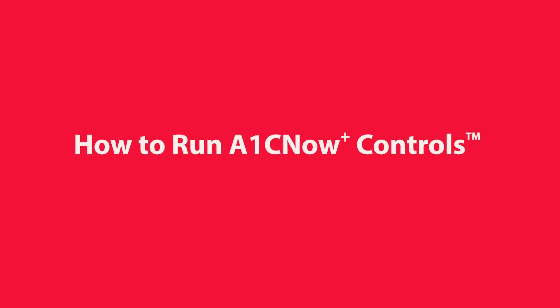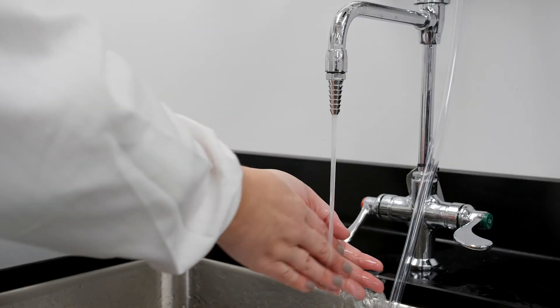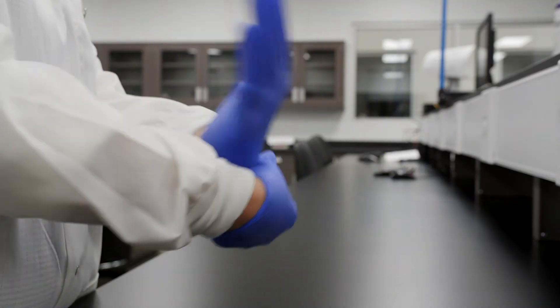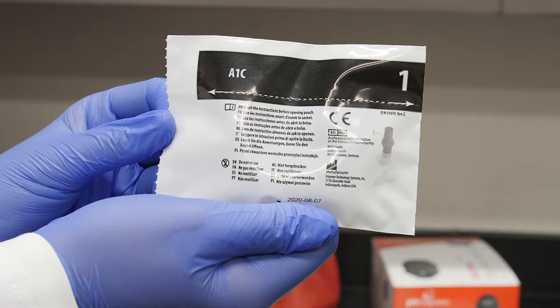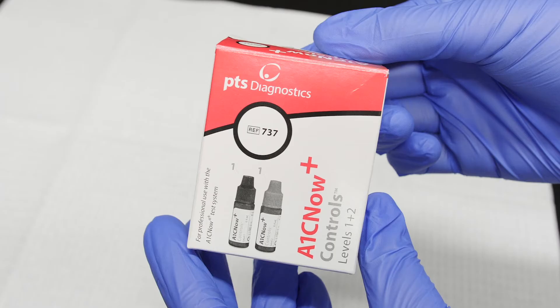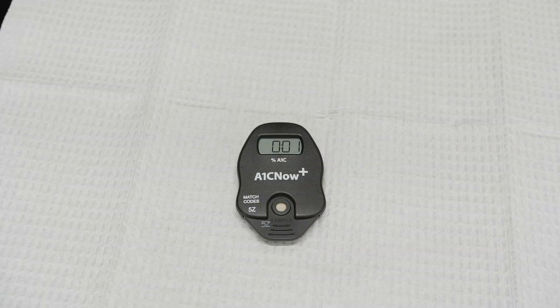How to run A1C Now Plus Controls. First wash, thoroughly rinse, and dry your hands, then put on your gloves. Gather the following materials: the A1C Now Plus Test Kit components, the A1C Now Plus Controls materials, the quality control instructions found in the box, and a clean flat surface.